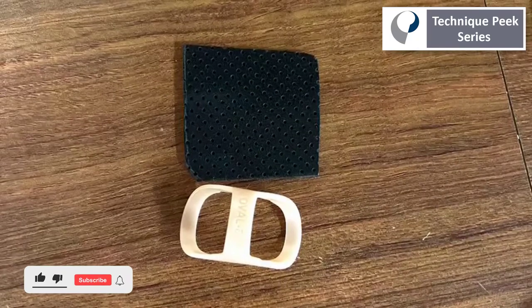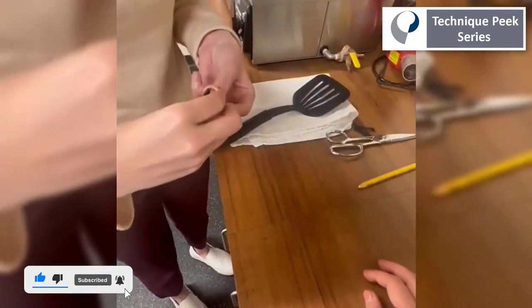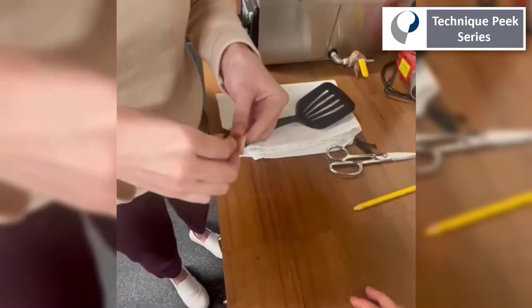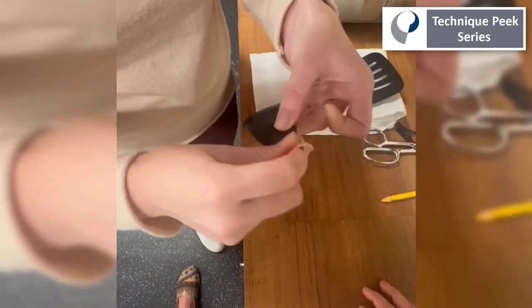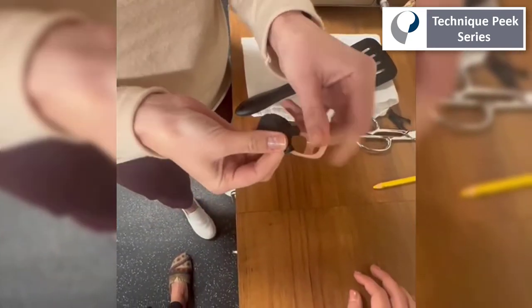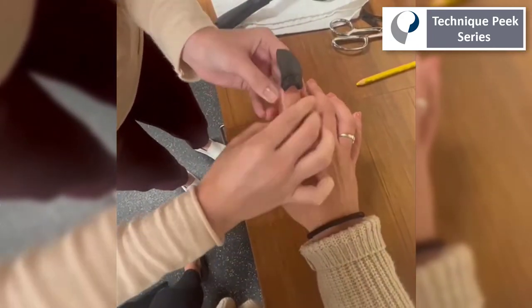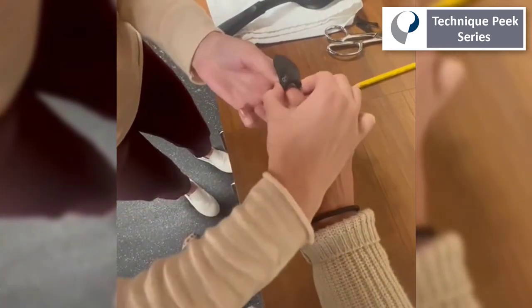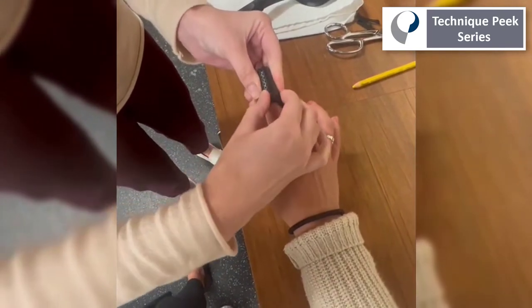We start with two pieces of material: one oval 8 and one small piece of thermoplast. Here we can see the therapist securing the piece of thermoplast material to the prefabricated oval 8. Once secure, she'll place the orthosis on the patient just proximal to the PIP joint to ensure no hyperextension at the PIP joint.